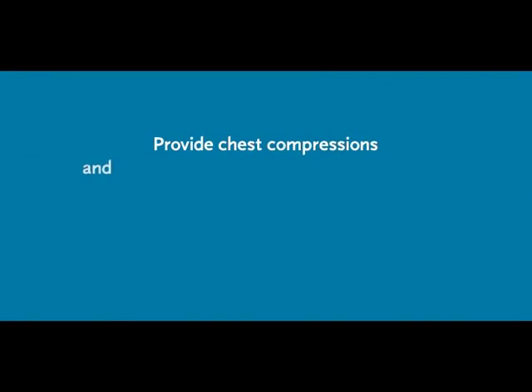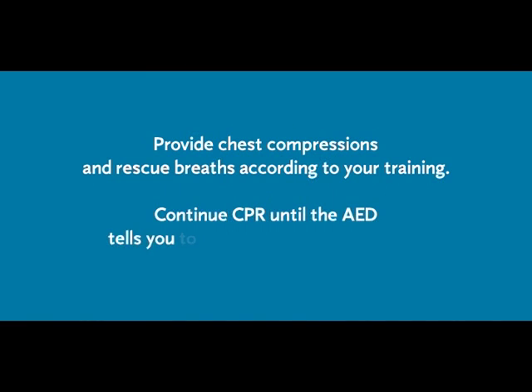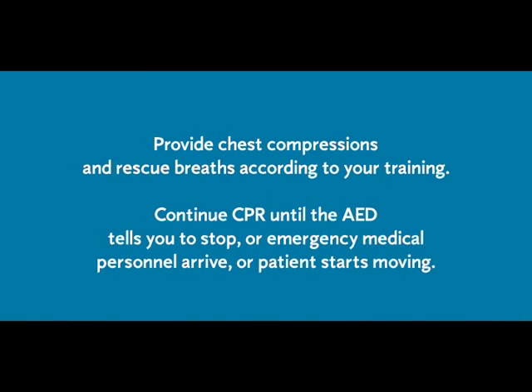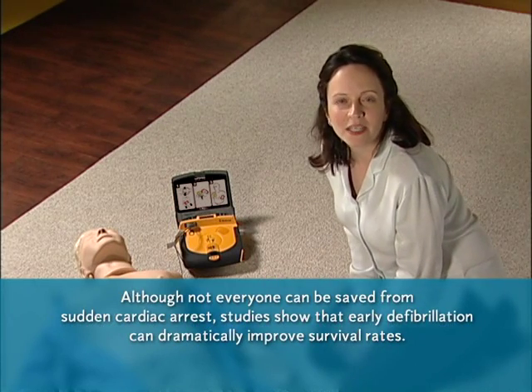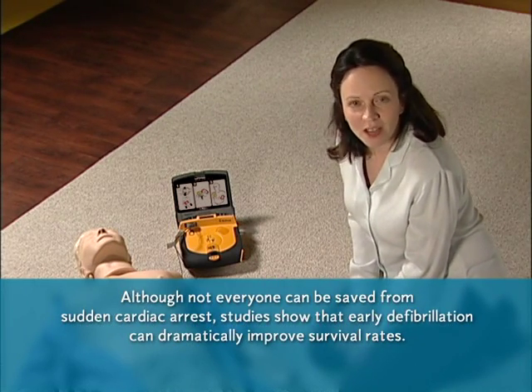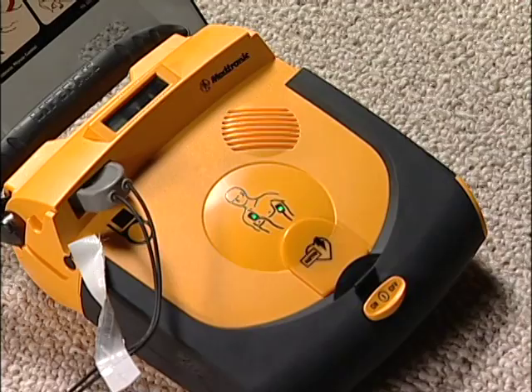Provide chest compressions and rescue breaths according to your training. Continue CPR until the AED tells you to stop, emergency medical personnel arrive, or the patient starts moving. While you're doing CPR, the LifePAK AED will interrupt you at intervals so it can check if another shock is necessary. Do not touch patient.